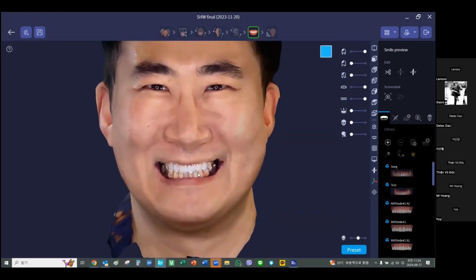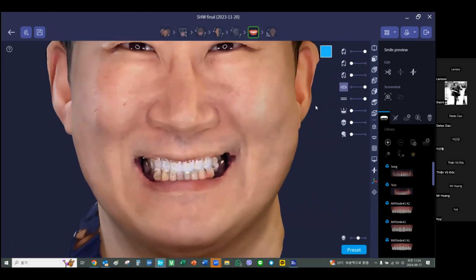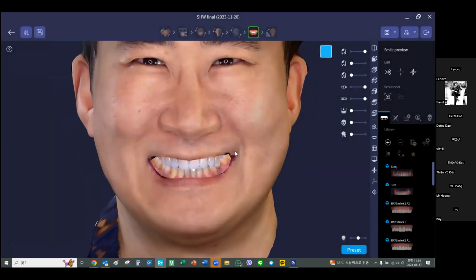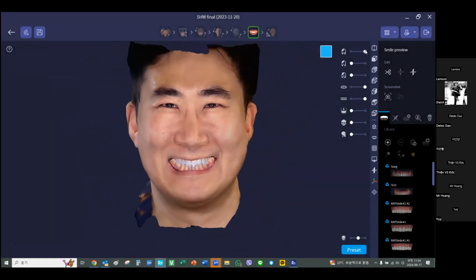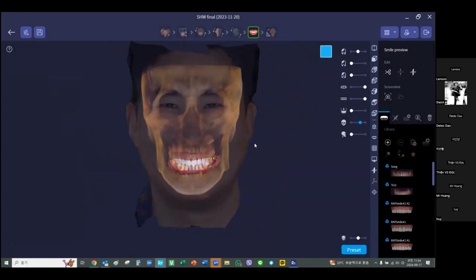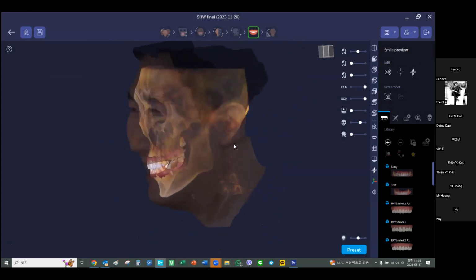Because this data is taken by our face scanner, to use all the data, we have to cut it again. Smile, cut. Now my full data is completed.